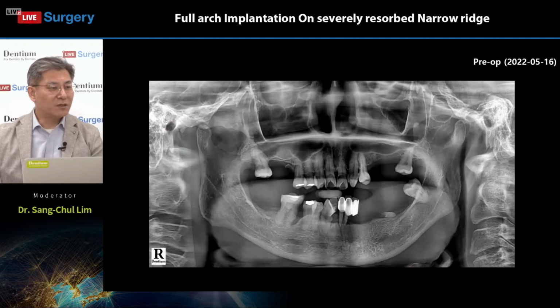About the patient's situation, we can see this panoramic view. As you can see, the lower jaw has very poor periodontal and dental condition. Only the two premolars, number 45 and its neighbor, can be saved, and the remnant of the teeth should be extracted.